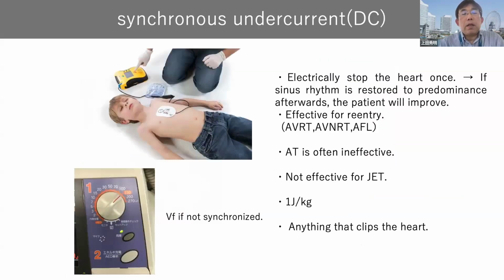This is synchronized cardioversion. It electrically stops the heart once. If sinus rhythm is restored to predominance afterwards, the patient would improve.